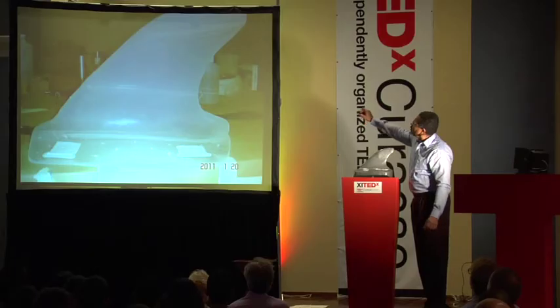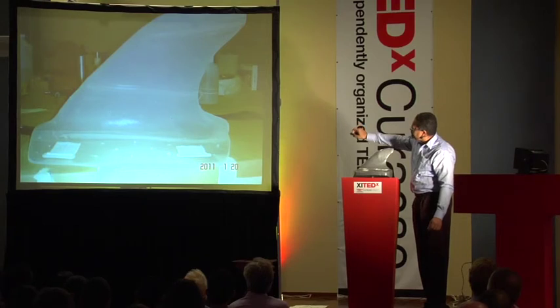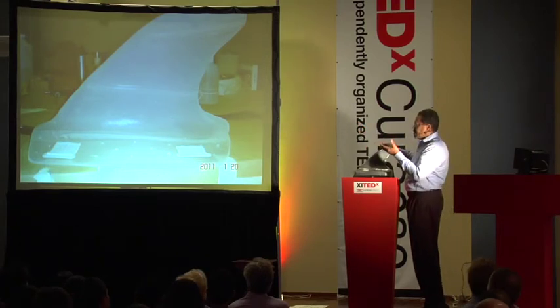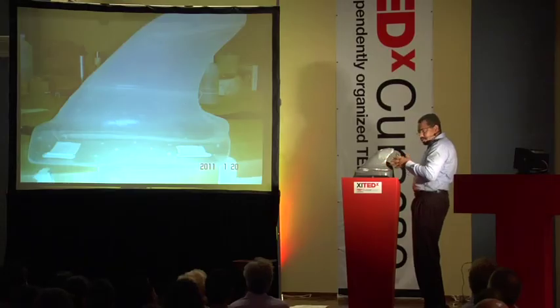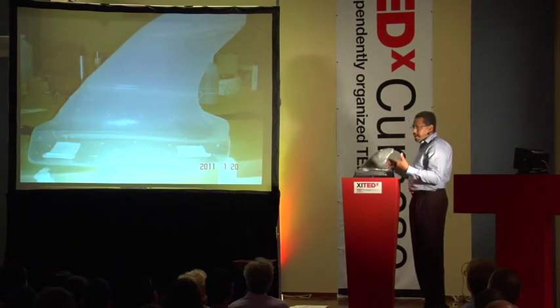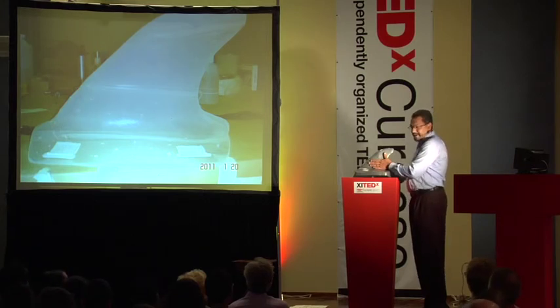Now, how does it all work? Here you see the completed device. You can see here the horizontal lines; these are channels that have an opening in the back, an opening in the front. And there was also an opening here in the back, the holes for the water to immerse inside. It is transparent. These holes made it possible for the water to come in from the front and flow through to the back. So we had water circulation, which made it possible for the animal to control its temperature without overheating.